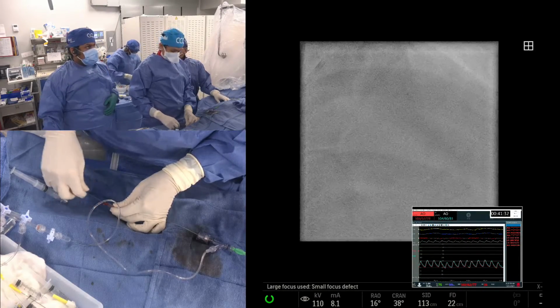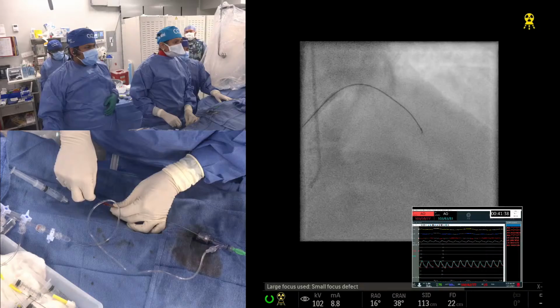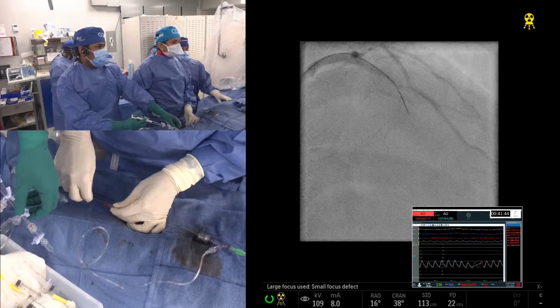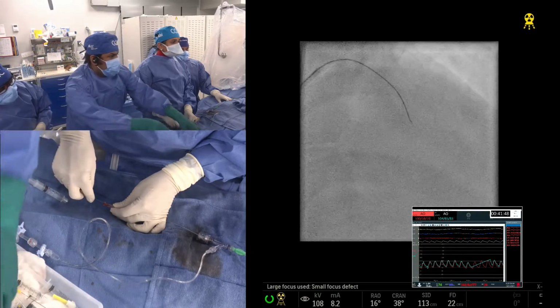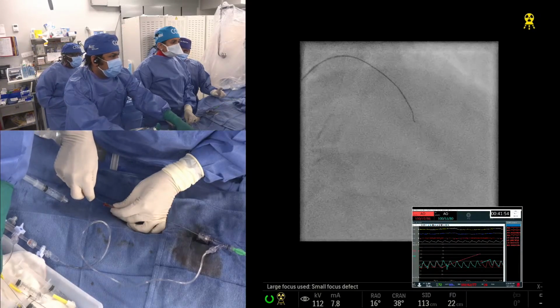The wire escalations you're doing are all illustrated in the app. So that would be another useful adjunct if people want to do it. Get hold of the CTO app and follow the case along. The guide wire app, yeah. So right now you have Miracle 6, right?